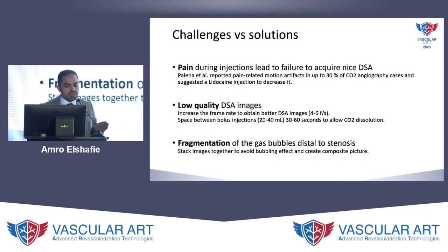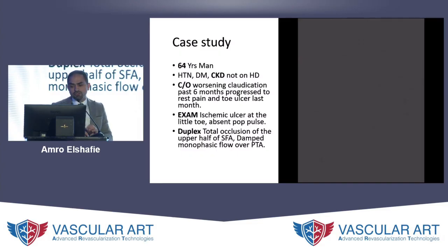Another issue is fragmentation of the gas bubbles distal to stenosis. This can be addressed by stacking the images together to avoid the bubbling effect of the CO2. And let me finish with this case.